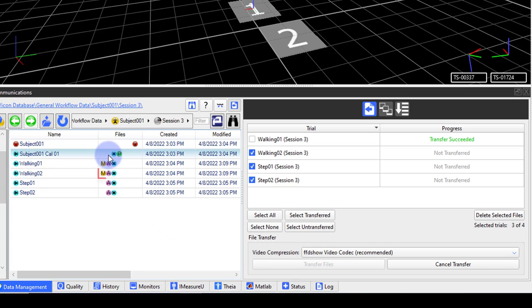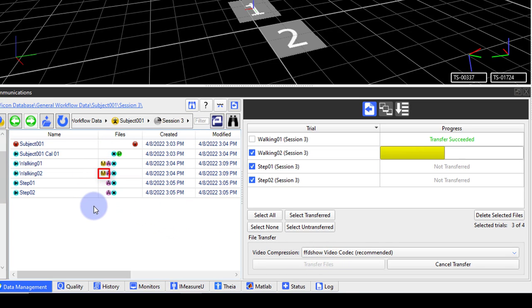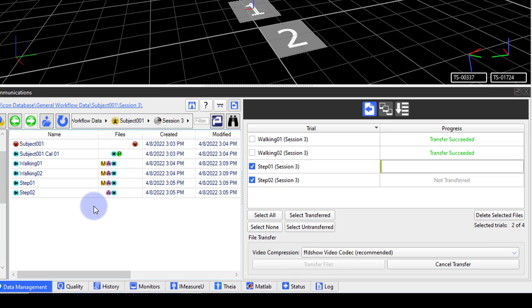You will see the status of the transfer in the progress column. In the data management, you will also see a yellow M appear next to each trial as the video files are transferred. If you have a lot of trials, this could take some time.